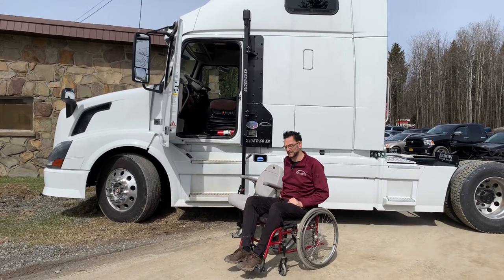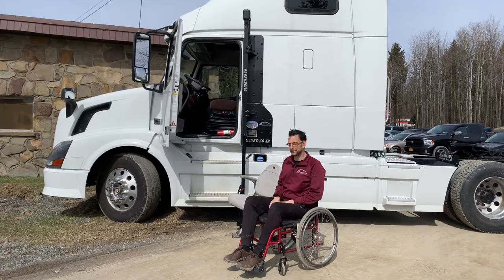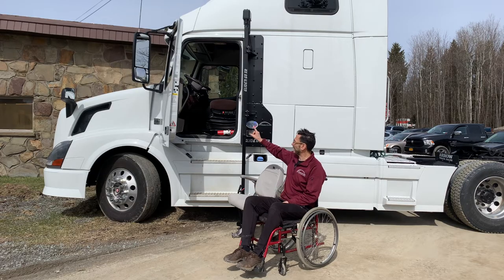Hi and thanks for tuning in to Access Unlimited's YouTube channel. Today we'd like to introduce you to an exciting new option for getting into a big rig, traveling, and even driving. The Glide and Go XR is a removable seat that you transfer into, rise up, and get into the driver or the passenger side of your big rig.